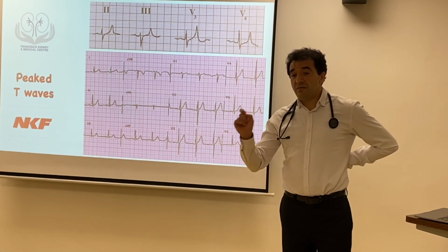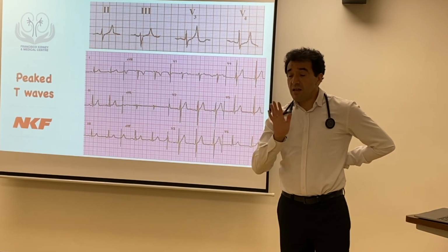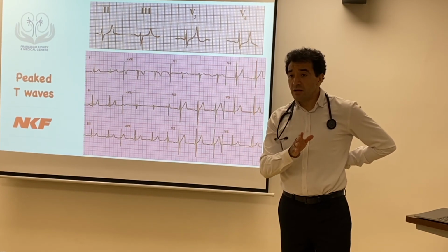Okay, so the heart rate was 80. ECG shows 80 plus. Okay, and the 40 was where? On our dialysis machine BP check.